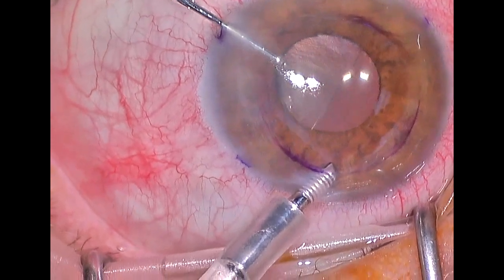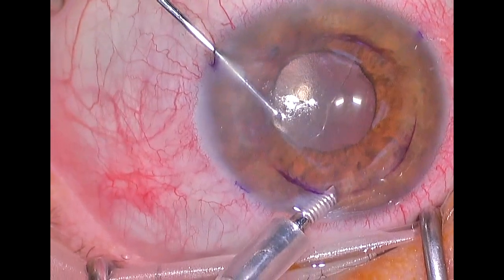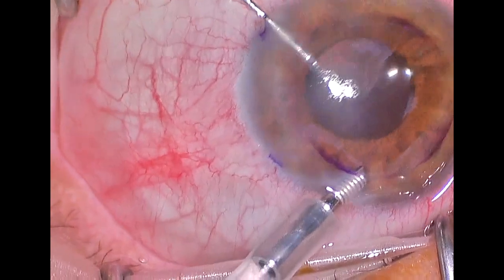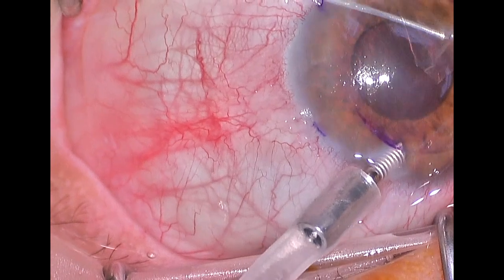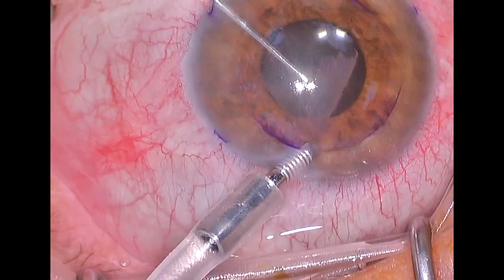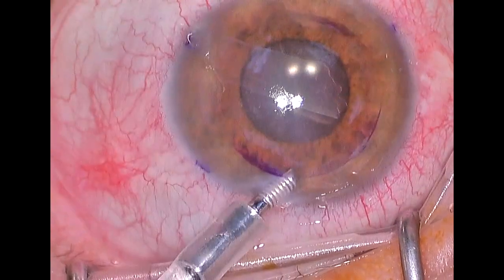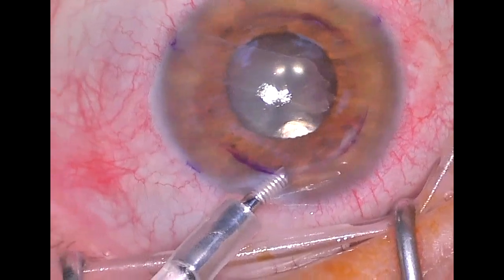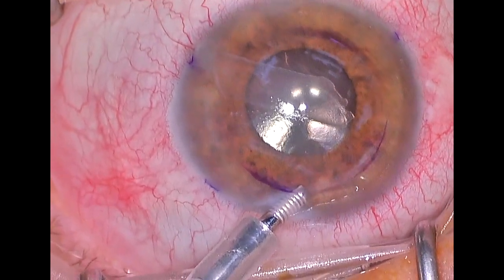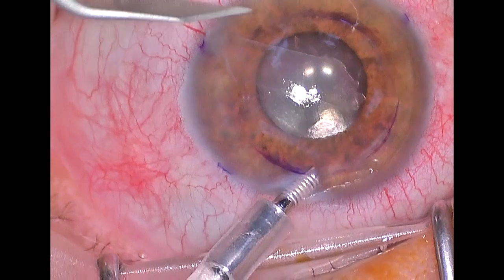There it is — it's very thick and a little bit hazy. Normal endothelial tissue shouldn't have that appearance; it should be thin and it should be clear. Once the endothelial tissue has been completely freed from the posterior corneal surface, it is removed. You can see we've got a scroll of that endothelial tissue, because once it comes off the innermost part of the cornea, it tends to scroll up almost like a poster.